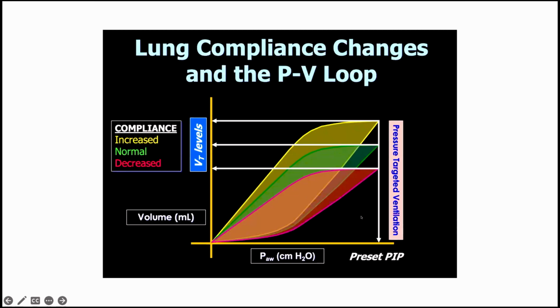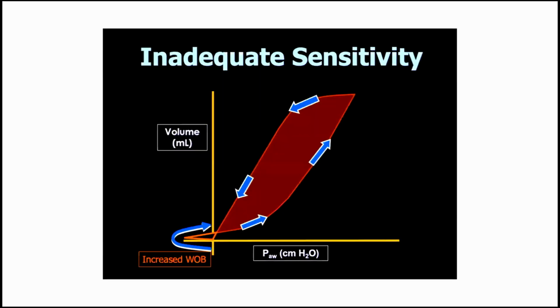This is just because of the difference between the volume control mode and the pressure control mode; this minor change in the configuration is happening.